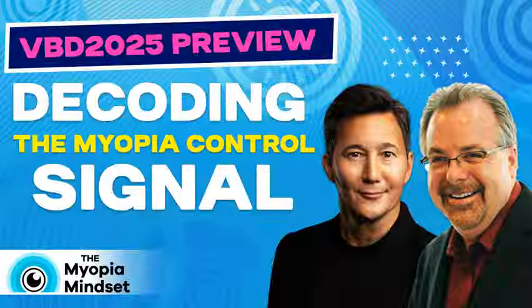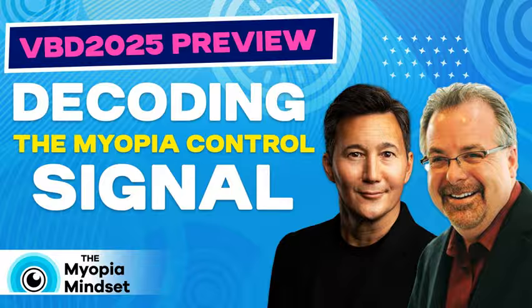You see these myopia control charts that show increasing myopia with time and so on. We're not going to stop until we put a child in Ortho-K and completely, to the best of our ability, limit their eye growth. Got to remember, kind of an important fact for the folks that are listening, the eye reaches its adult axial length at about age 5, 23.5 millimeters.